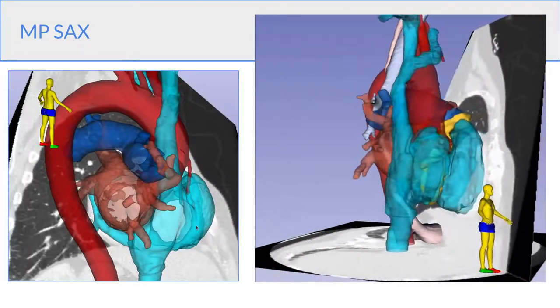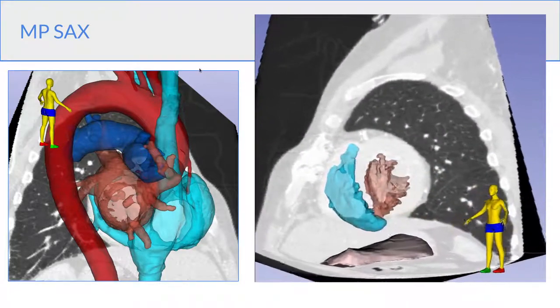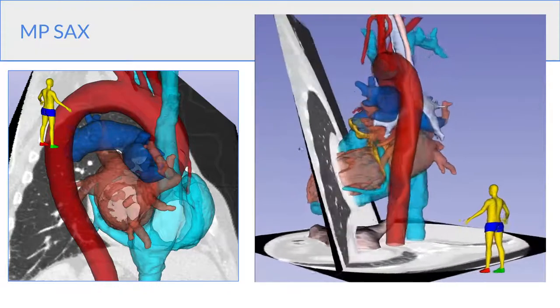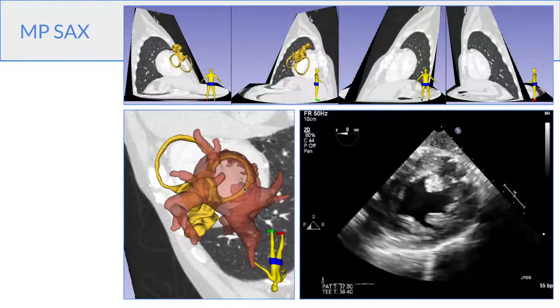So in transesophageal echo, our main window onto this view is the transgastric mid-papillary short axis. So here we have the same view now with all the cardiac structures, and an on-FAST view corresponding to your transgastric short axis view. And here again, the slice represented at the top, the on-FAST view at the bottom, and the echo clip.